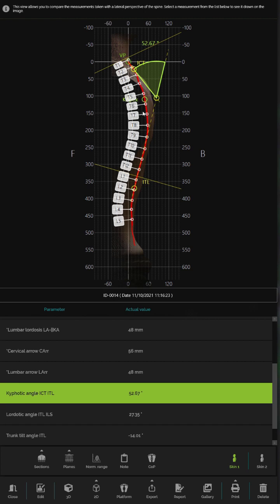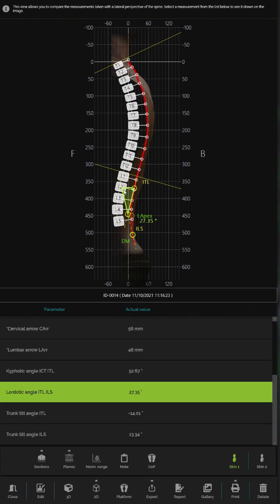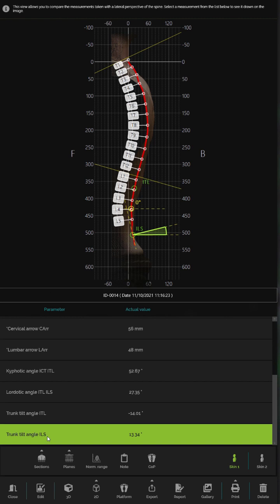And you can see that there's an unevenness to that thoracic curve. There's a sudden oblique change around the T7, 8, 9 region. This may have been caused by previous trauma, but it will definitely put an extra stress on that TL junction.